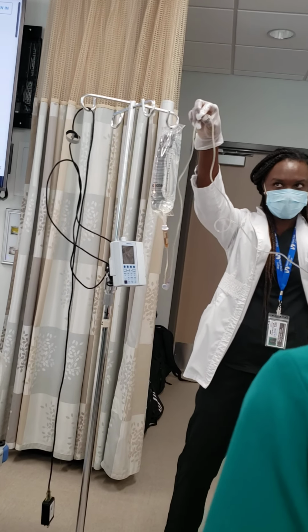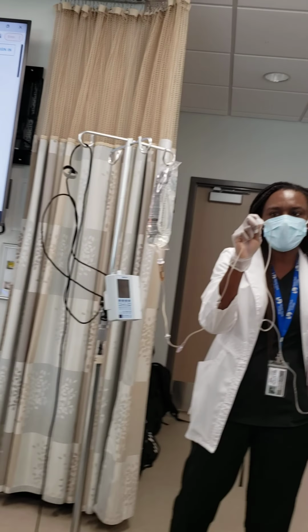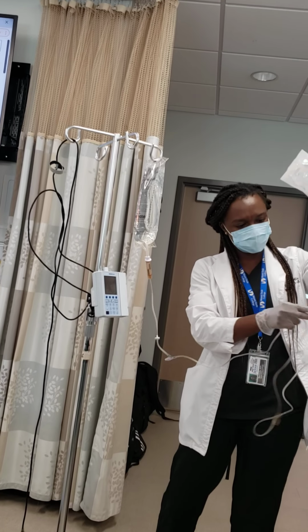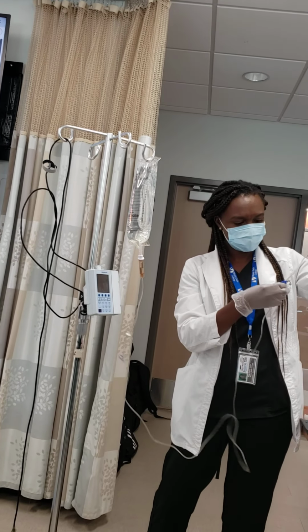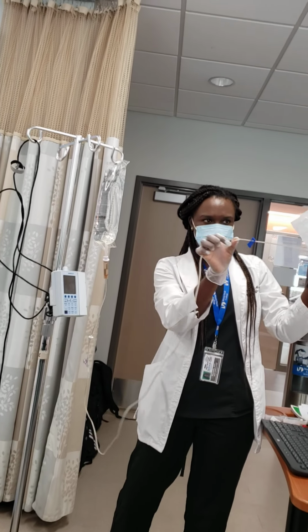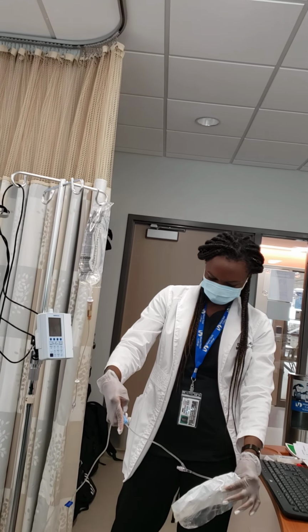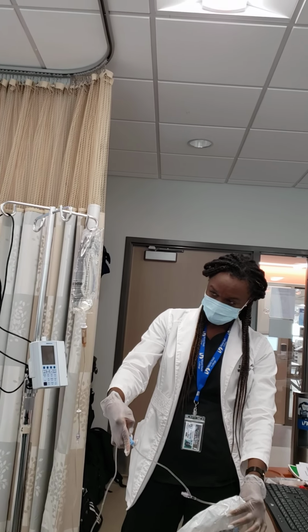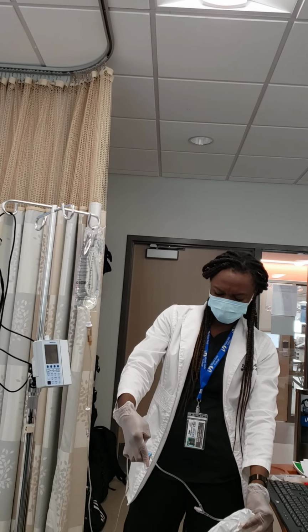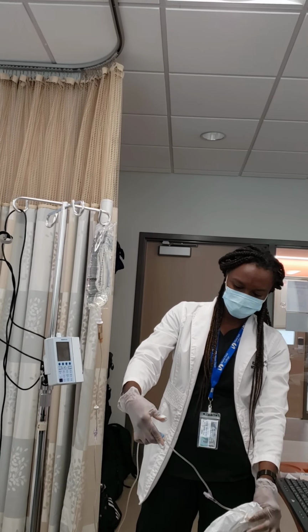If it's this small, there's no worries. This is not gonna kill the patient. But I will tell you, if you see anything like this, definitely flush it out. You see it? So you can only get rid of them by flushing, or can you tap it a little bit? Even if you tap it, it's still not gonna go, because it has to come out.